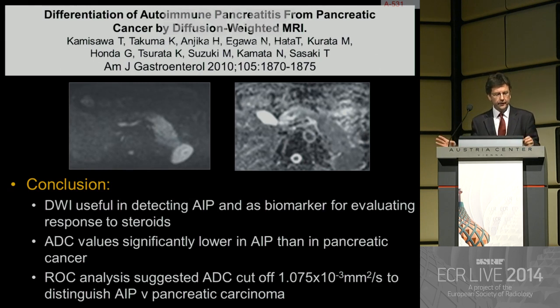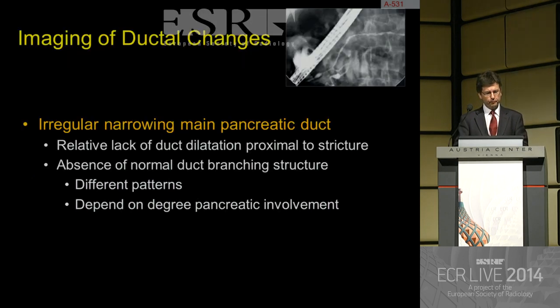In this paper particularly, with the ROC analysis, they talked about a significant ADC value. I put it in here as part of the conclusion, but I would say take it with a pinch of salt because there is a significant overlap between the different types of disease.